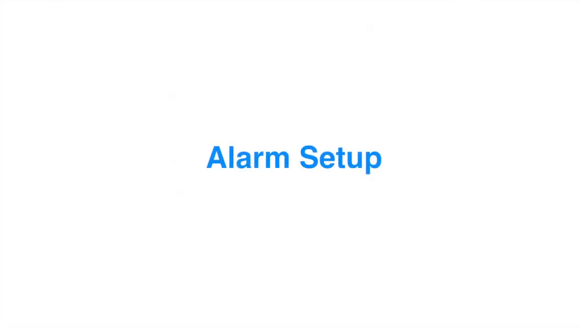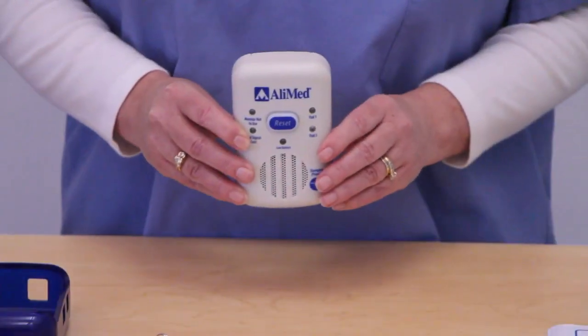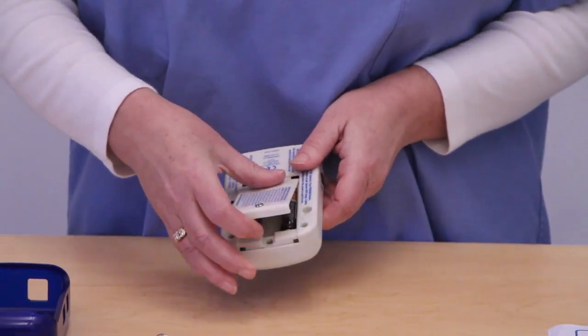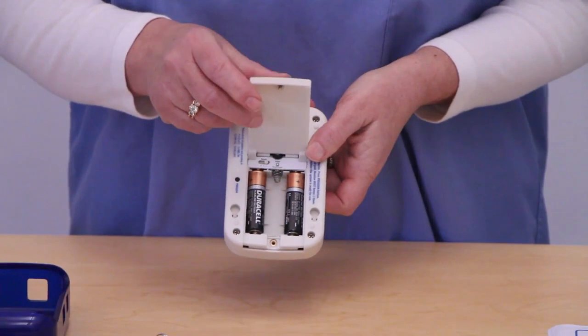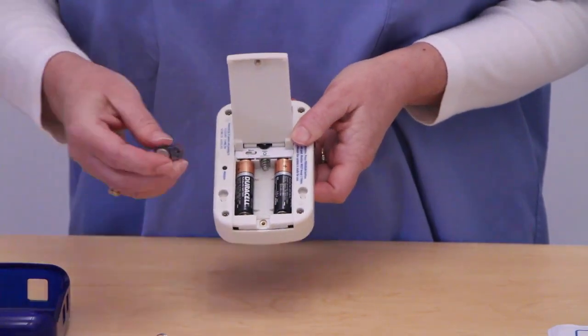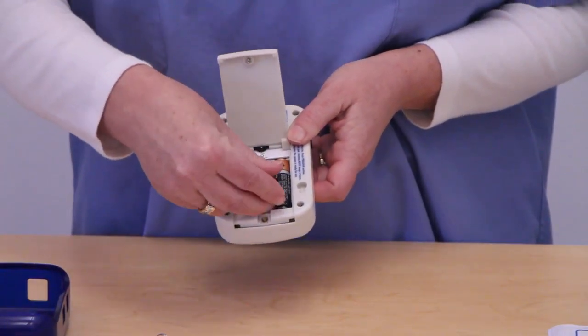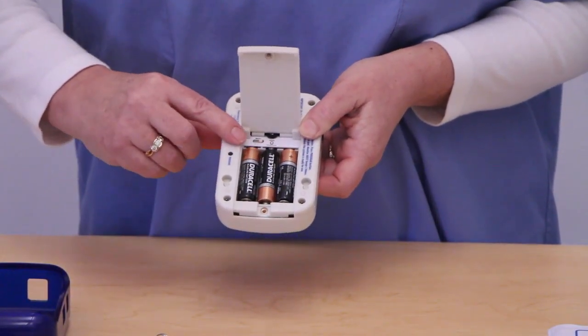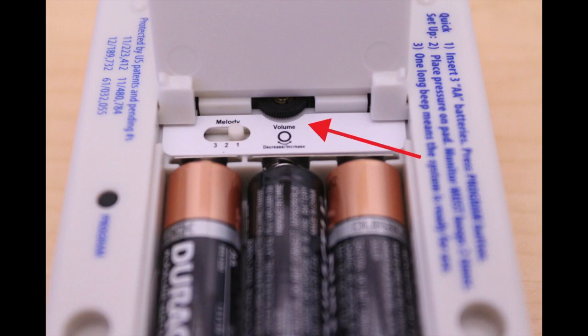Alimed's cordless alarm is easy to install and use. To begin, simply unscrew the back of the alarm and insert three AA batteries. The alarm will automatically turn on. While the battery panel is still open, select preferred volume and alarm sound settings.